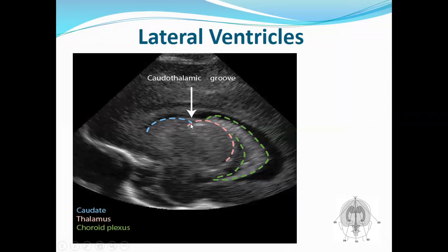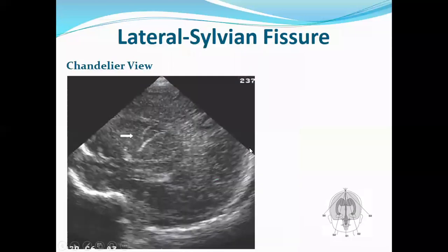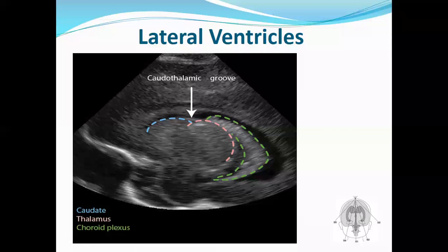If you move from where you were, 1, 2, we take this one. This is the third one we are taking. So you are able to appreciate the lateral ventricle fully. If there are any bleeds here that you didn't pick up on the previous image, you'll be able to pick them up here, behind.